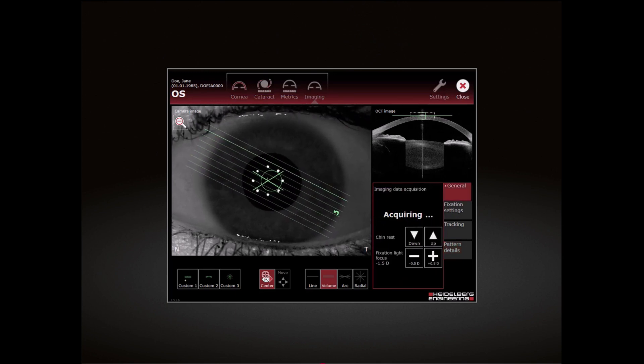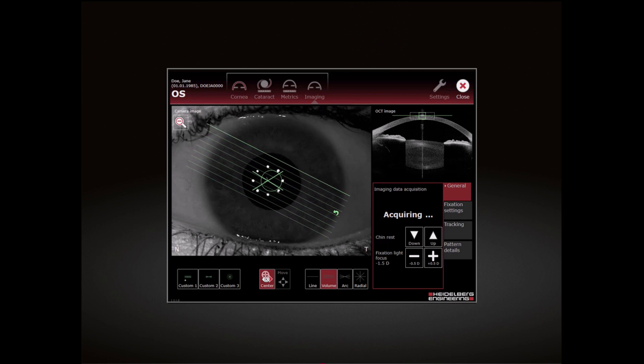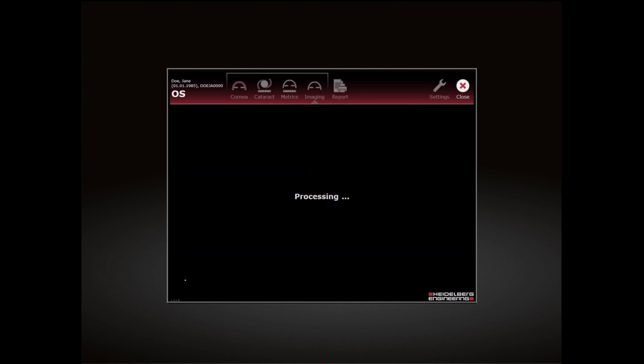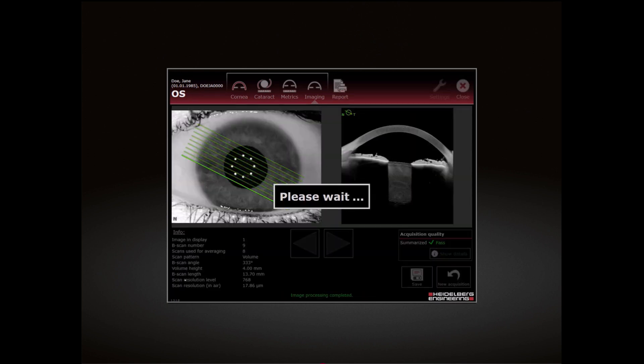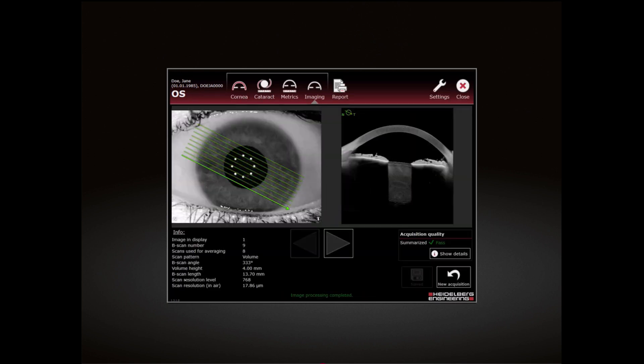Keep the device as still as possible. The examination stops automatically.